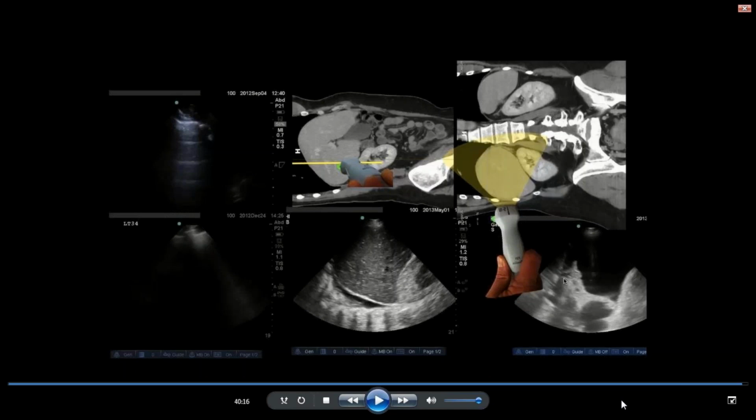So it actually turns out that you can detect evidence of asbestosis and mesothelioma because many times there are significant pleural changes. And as was mentioned several times, the pleura can be visualized very well, especially with high-resolution linear transducers.